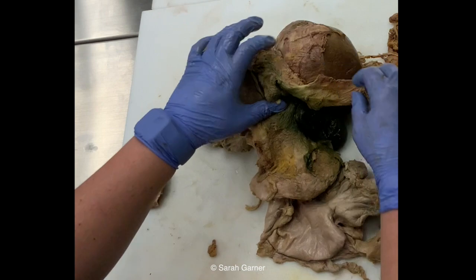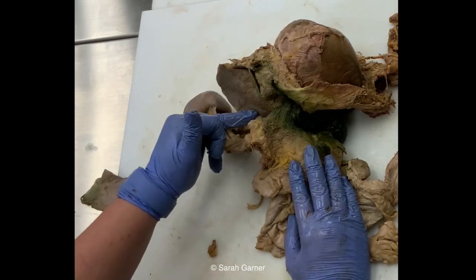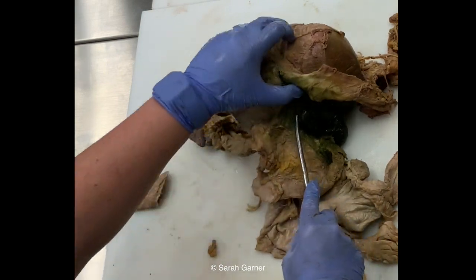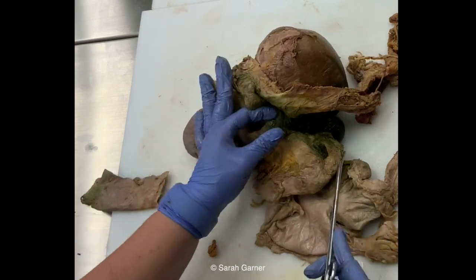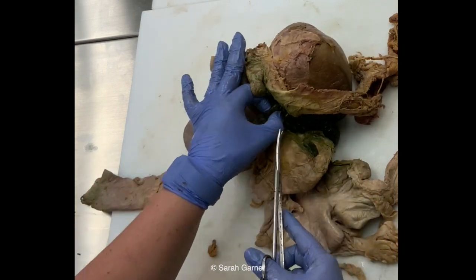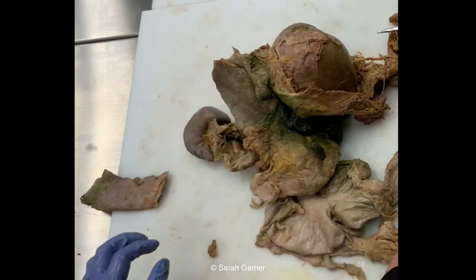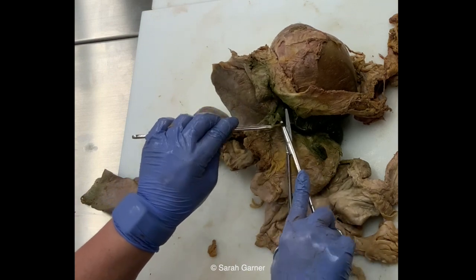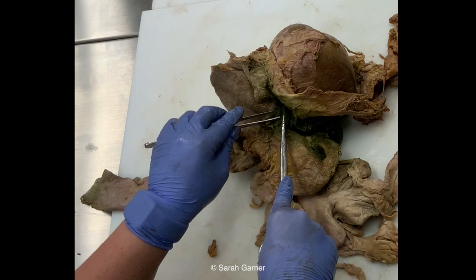So with this, if you were being lazy, you could just take a scalpel and cut across there. In my opinion, you should actually dissect out the porta and know what you're cutting. You don't wanna just cut things to make it quick. You want to actually know what you're cutting. So you can do some nice little blunt dissection here, kind of open up this area.